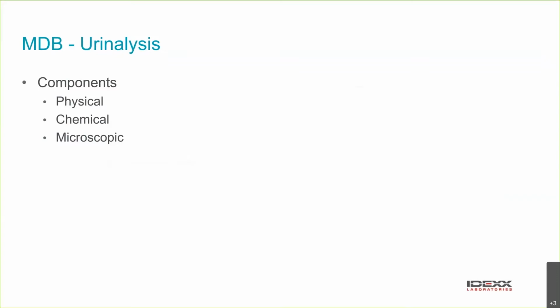Obviously, doing the microscopic exam is the more time-consuming part of the urinalysis, and sometimes it gets left out because of that. But I would encourage you, wherever possible, to include that microscopic exam because it can certainly provide us with useful information.